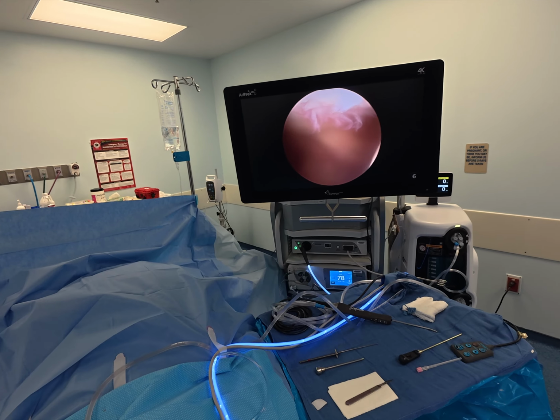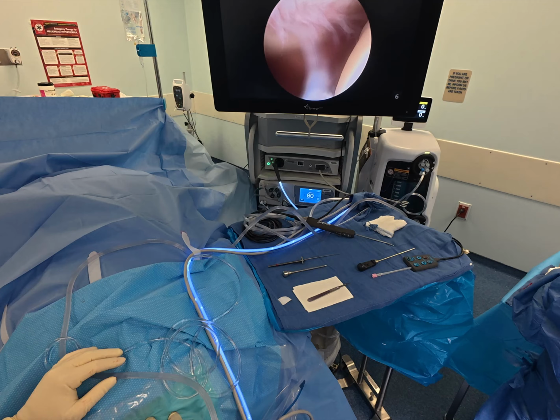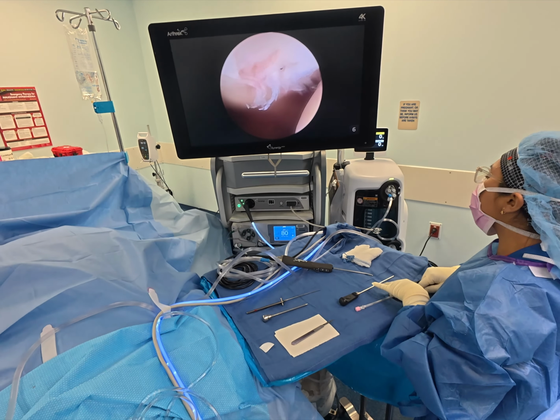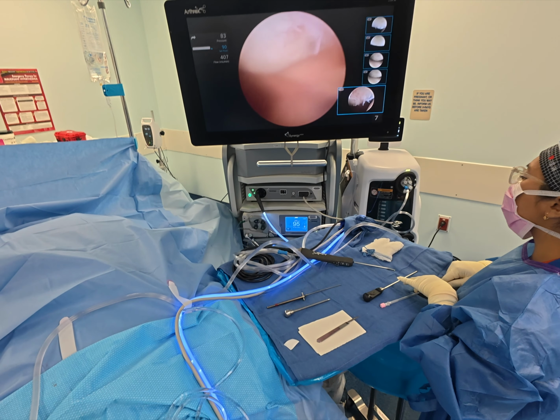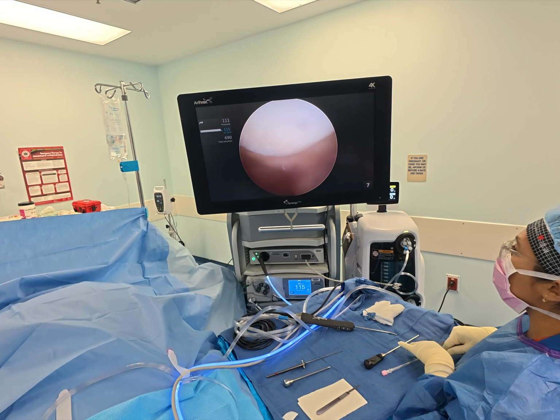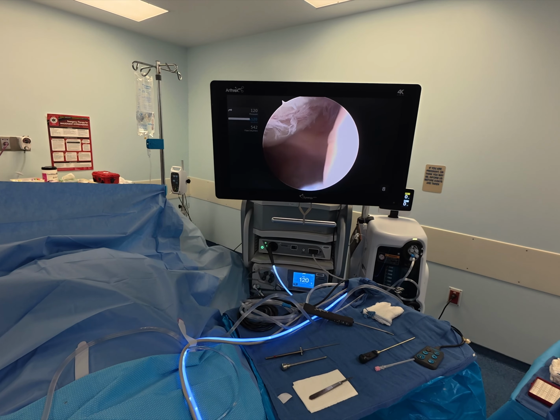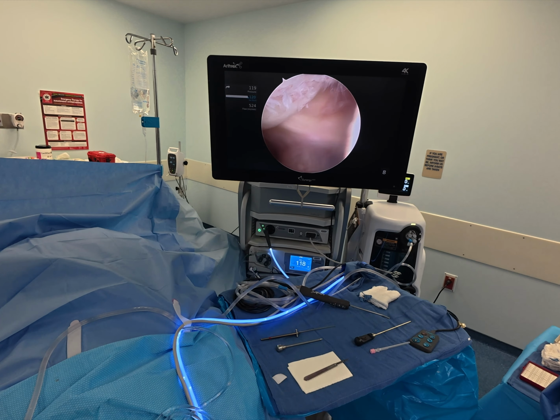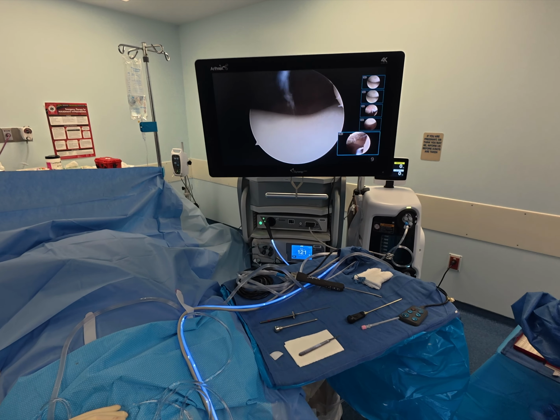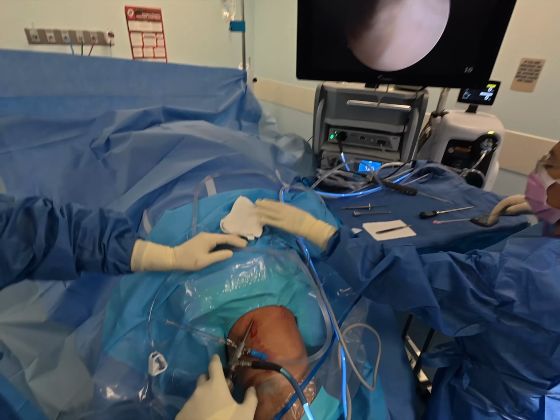And certainly it's much worse there on that view. So there's no cartilage there essentially. Raise the water pressure 120. There's no cartilage there. That's just bone exposed. That yellow is just bone exposed. So, and then it gets normal again. So that's normal looking cartilage right there. Normal cartilage. Severe arthritis. That's grade 4 chondromalacia. Bone is exposed. Essentially the bone is denuded of its overlying soft articular cartilage. It's supposed to look like that. That's the trochlea of the femur. Normal. So let's go now into the medial compartment.